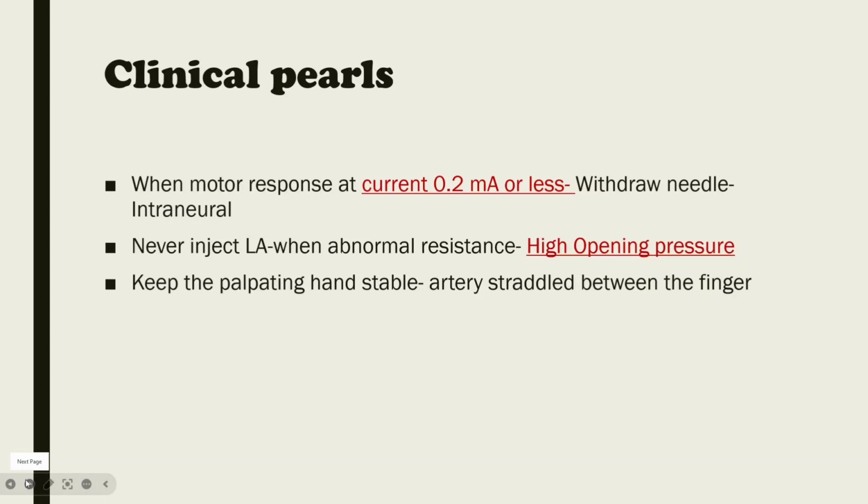Never inject the local anesthetic when there is pain or the patient complains of pain, or when there is abnormal resistance or high opening pressure. Always keep the hand stable while palpating, so you can fix the artery and needling can be easier.